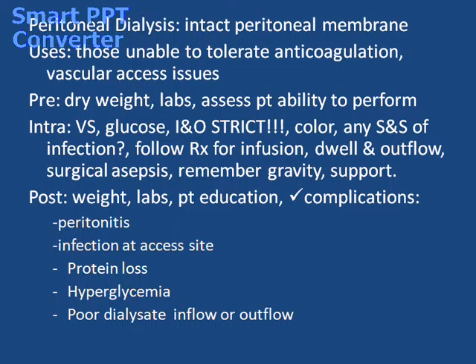We're going to look at the site and assess for any wetness, because we don't want any dialysate leakage. And prior to instilling the dialysate, we want to make sure it's the correct temperature. We don't want to put it into the microwave because the microwave will heat it unevenly, so we want to make sure that we put it in the proper heating device if one is available, or we're going to pull it out of a cold room and warm it up somehow, but not in the microwave.